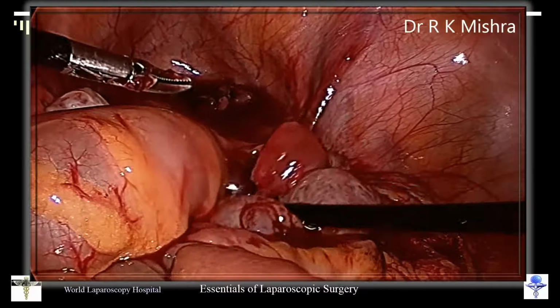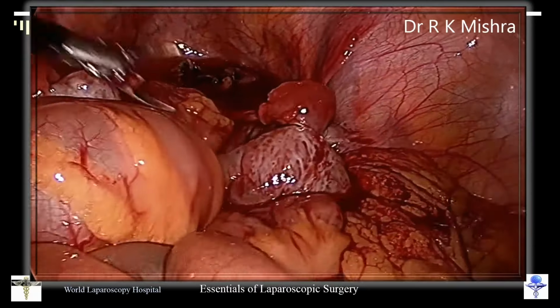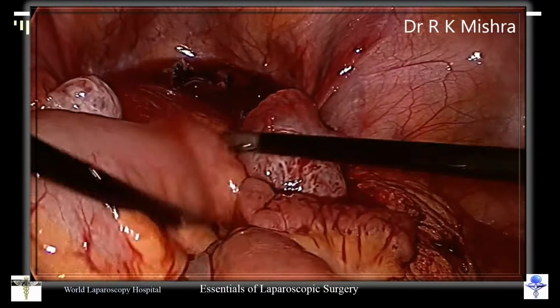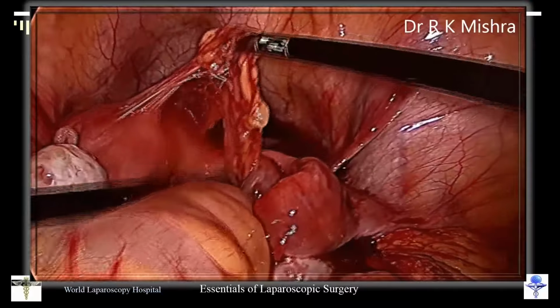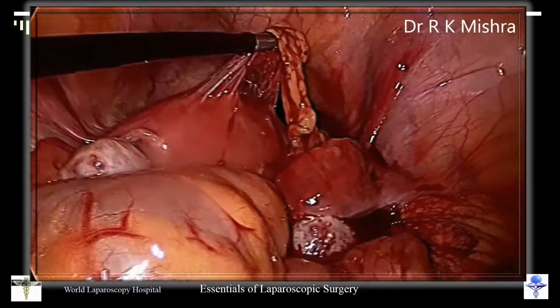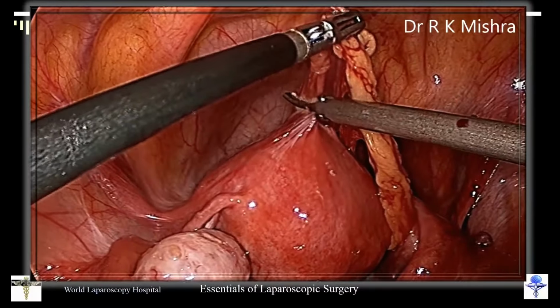Again here it was found that omentum has done some more problem here, preferably on the previous scar it is adhered, and that is the way it has made a tag around the ovary. So, better to remove all those omentums and adhesiolysis should be performed. So, you can bring the harmonic and do the adhesiolysis of those.